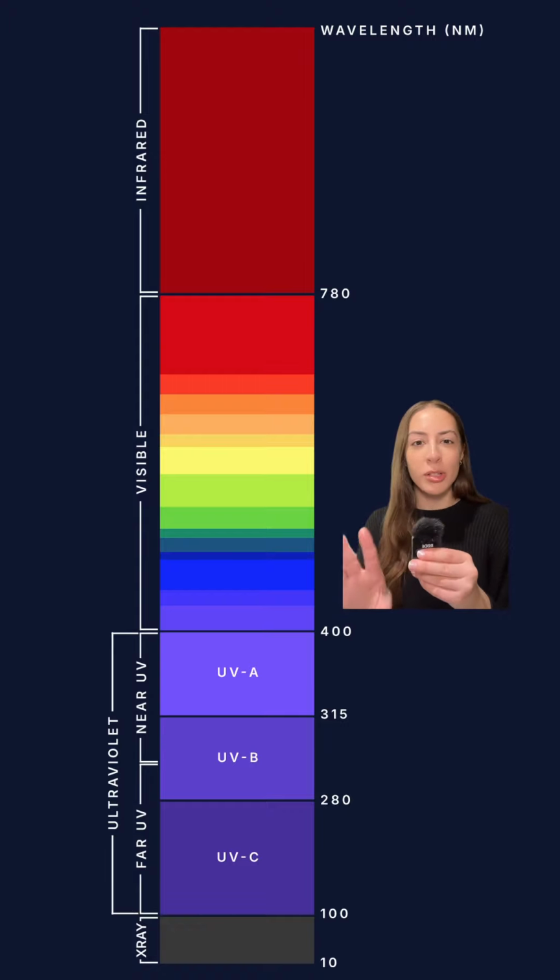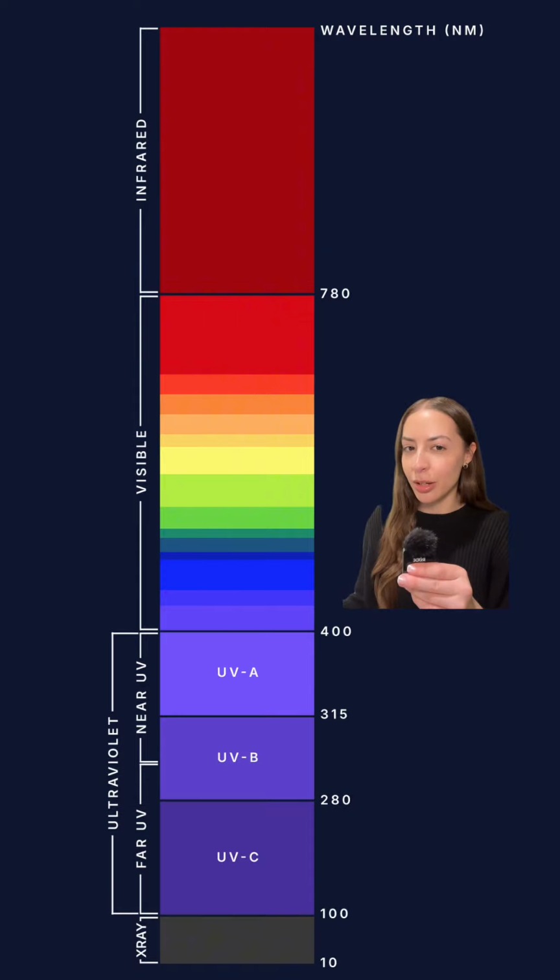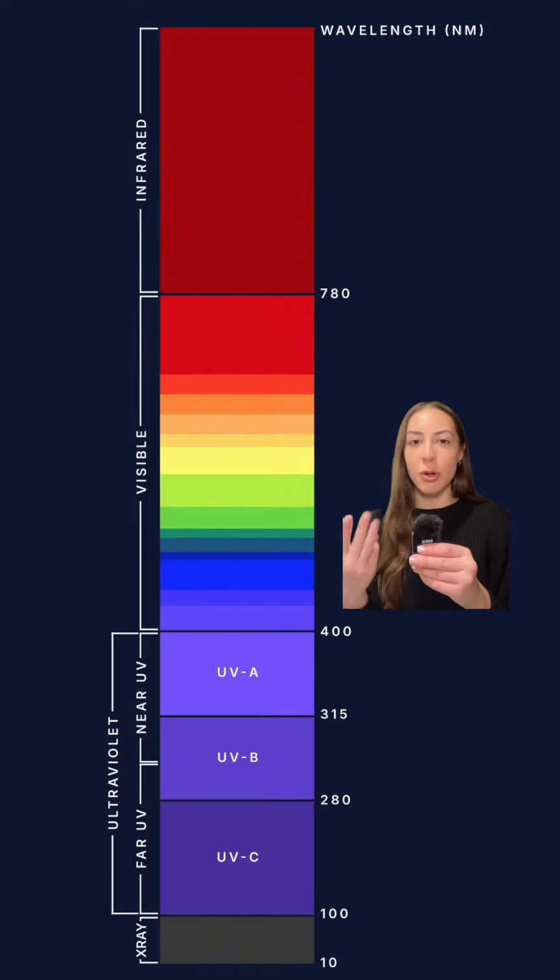At first glance, a broad spectrum approach may seem more effective, but when it comes to microbial inactivation, wavelength energy, absorption, and exposure time are what determines germicidal efficacy, not wavelength variety. Let's take a closer look.